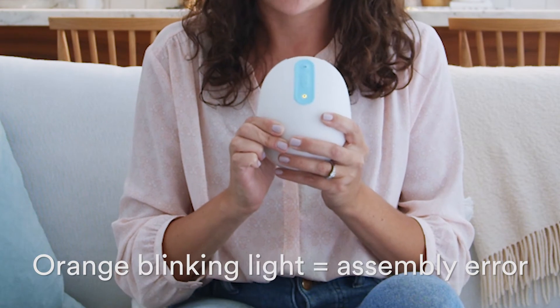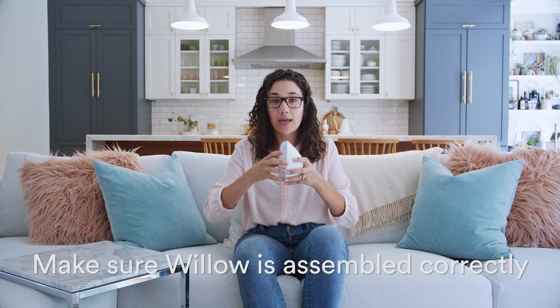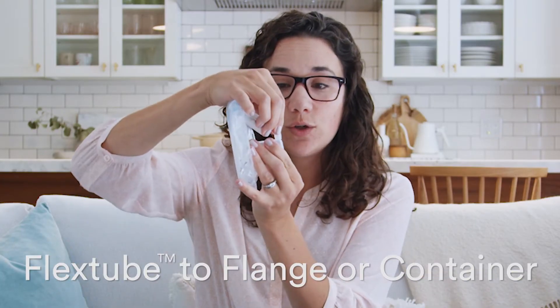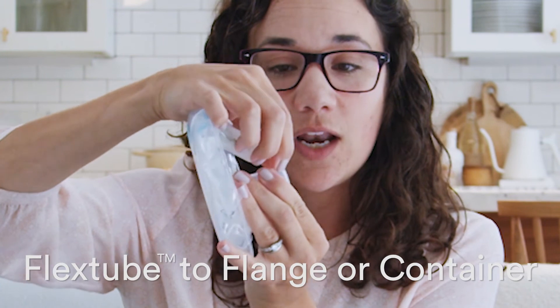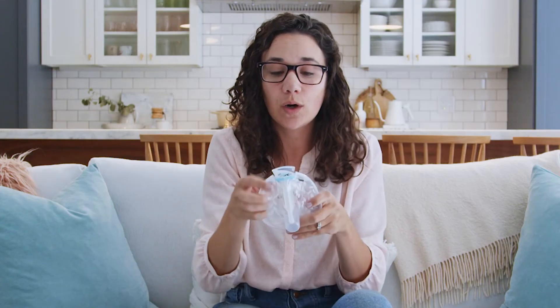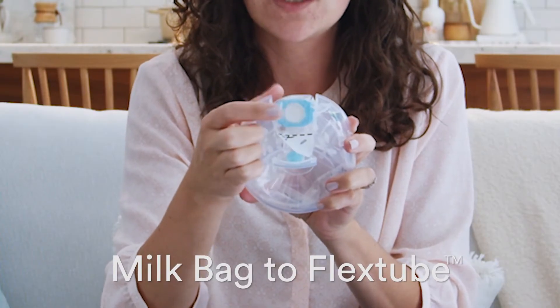When you get a blinking orange light, there are a couple of things to try. It means you need to check your assembly. Start by separating the pump and the flange. Check that the flex tube is secure and all the way down to the flange spout. Open the door and make sure the bag valve is securely on the flex tube.